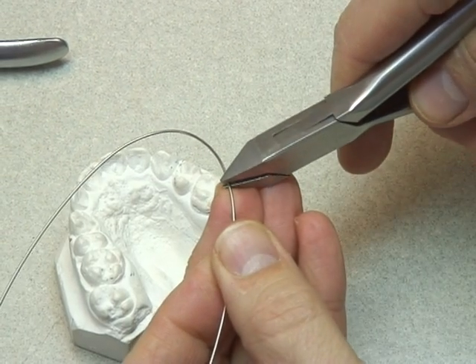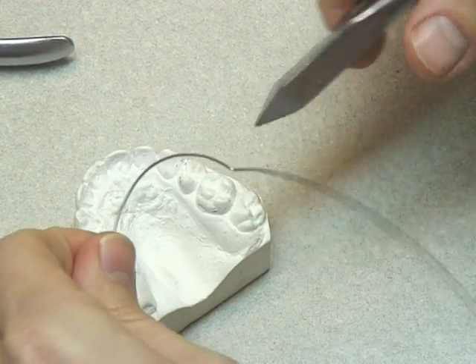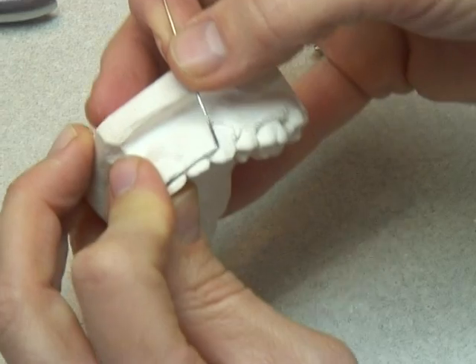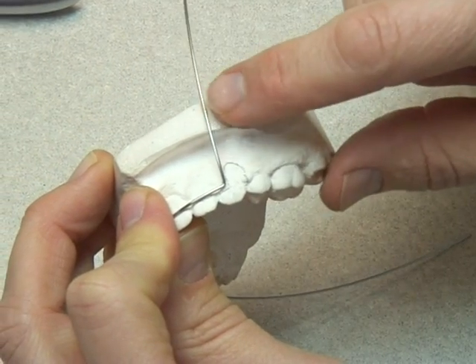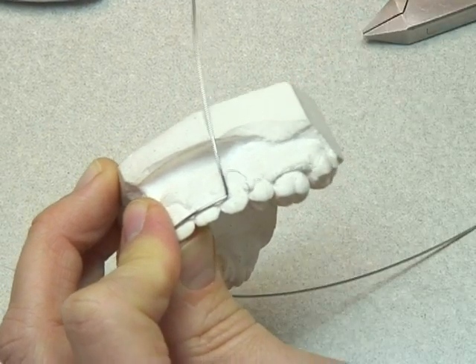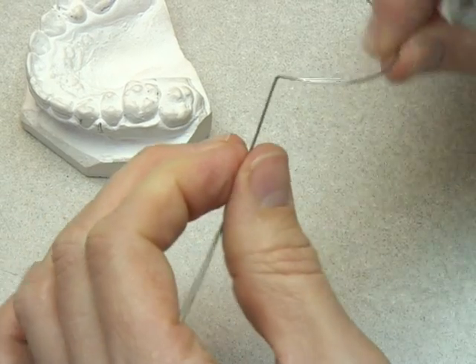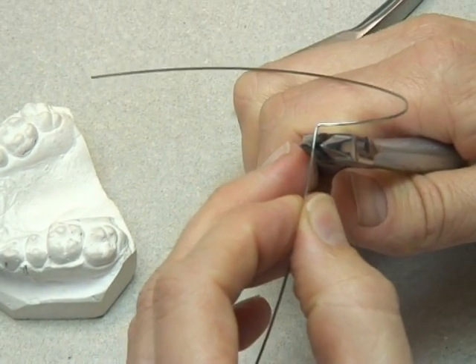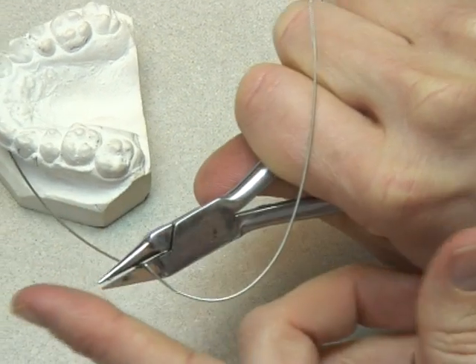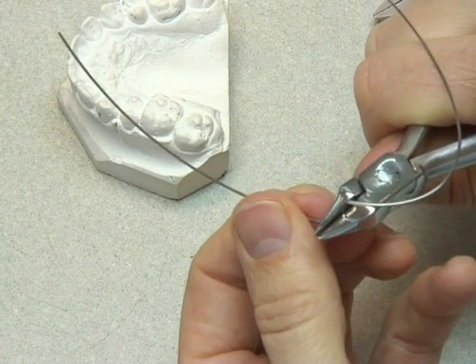You should also ensure that the labial bow follows the occlusal plane — nice and level and horizontal, with no wavy appearance. Mark off on the canine, at the middle of the canine, the position that we need the first U-loop. Then carefully repositioning the wire back on the model, we take a guesstimate as to how long we need this U-loop to be. Following the arch shape, we use the round part of the spring-forming pliers to form a U-loop, making only half of it initially.